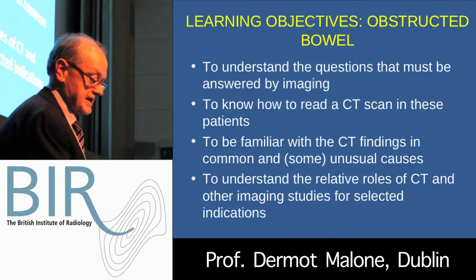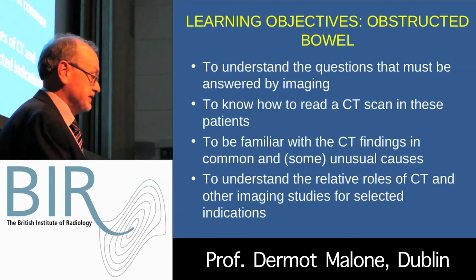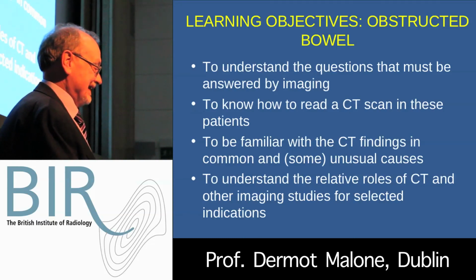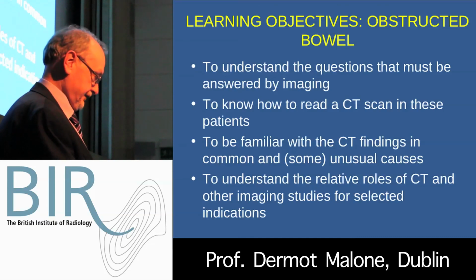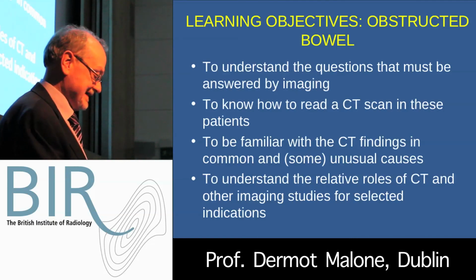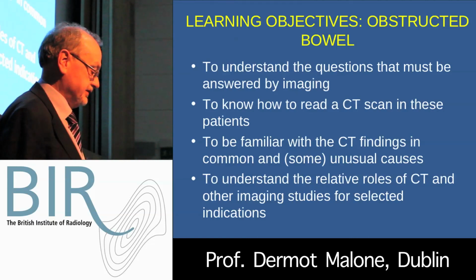So I hope this has helped to understand the questions we need to answer, clarified how to read the CTs, given you some images, in your own minds, of common and unusual causes, and we've clarified some of the relative roles of CT and other imaging studies for those indications.